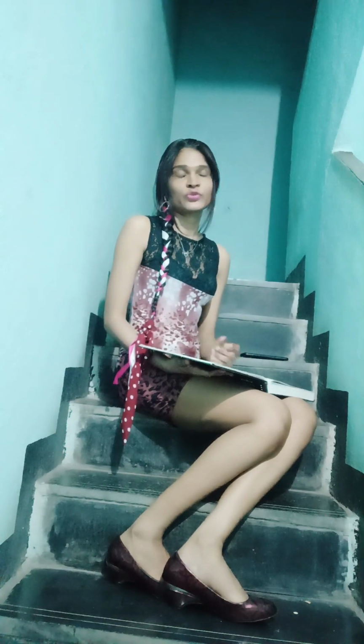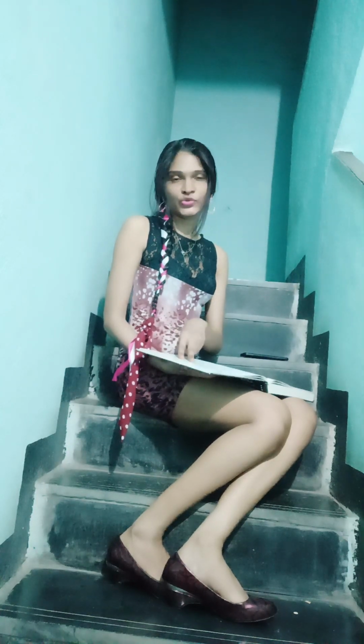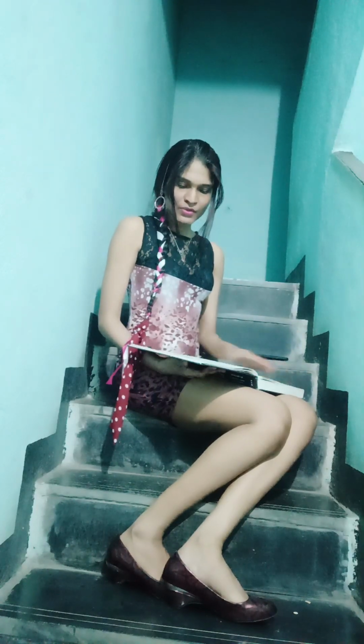Then what are the advantages of indirect gonioscopy? First, it's a rapid technique, especially with the 4 mirrors. And then indentation gonioscopy is possible with indirect gonioscopy, because the posterior radii of curvature are similar to that of the anterior curvature of the cornea, and also the diameter of corneal contact is small, so that when they're indented, they push the aqueous into the chamber and the anterior chamber angle opens. So we can use it to distinguish between synechial closure and appositional closure. So these are the differences between direct and indirect gonioscopy.